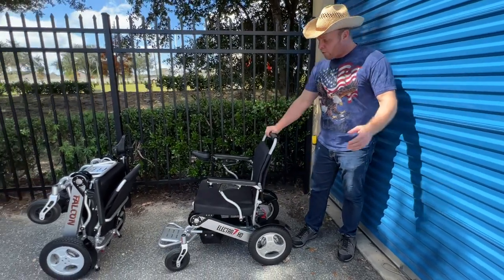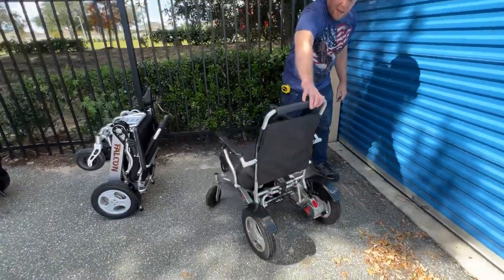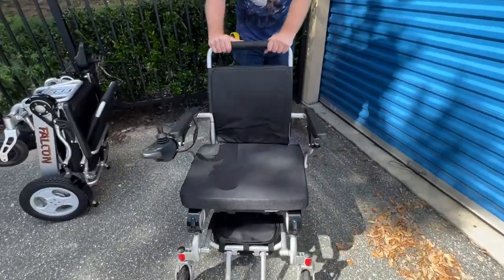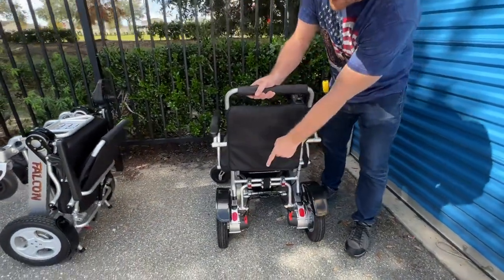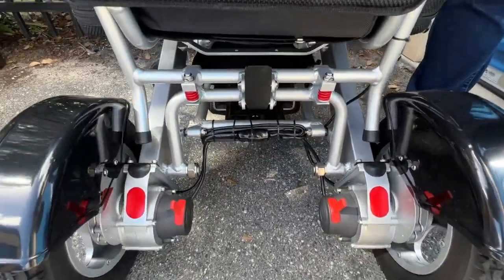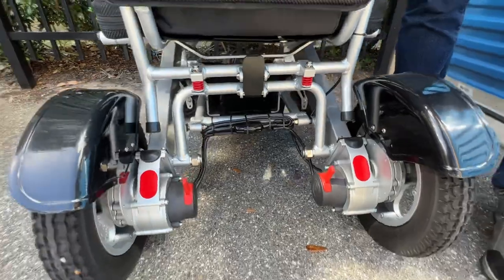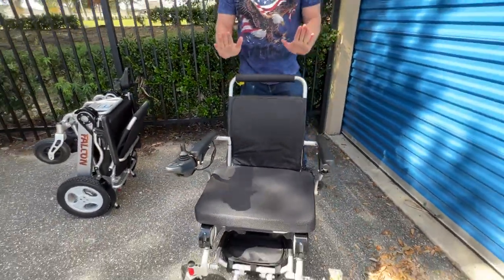You can see the chair folds literally in a second. This is an FDA and FAA approved chair, so you can take it on the airline. The Electra 7 has two 250-watt motors, the DuraShock suspension system in the rear, and a very simple fold design — very easy to fold. There are a lot of other safety features and I've made quite a few videos about the Electra 7.